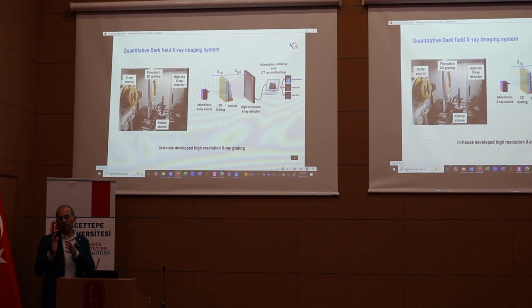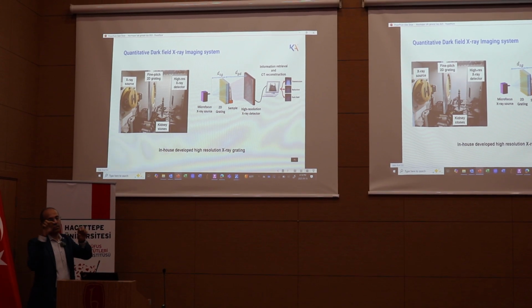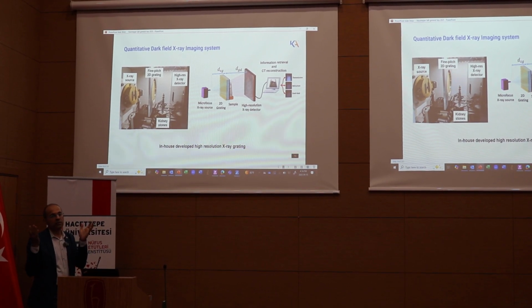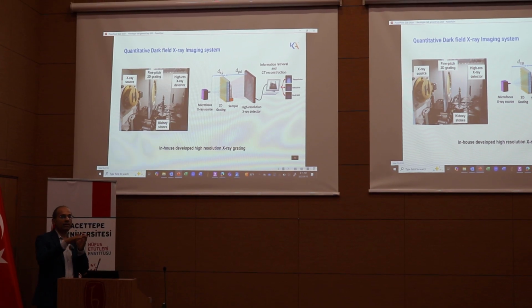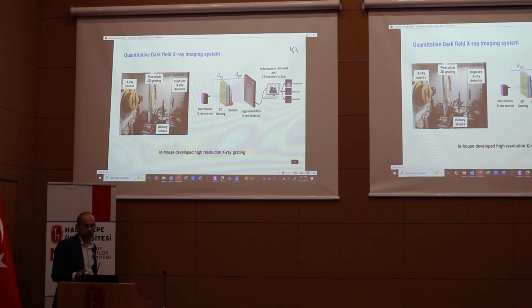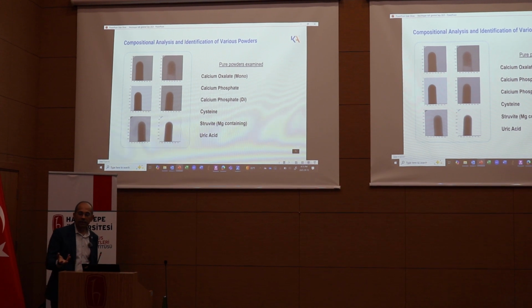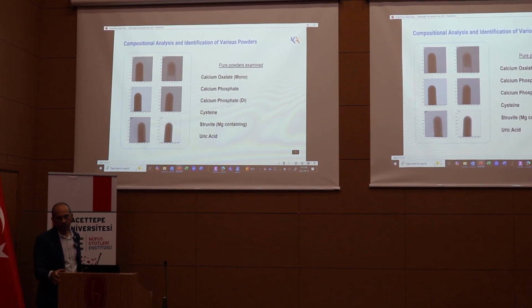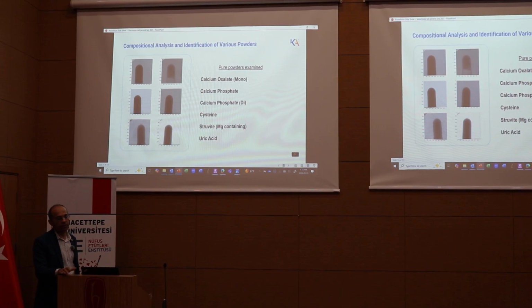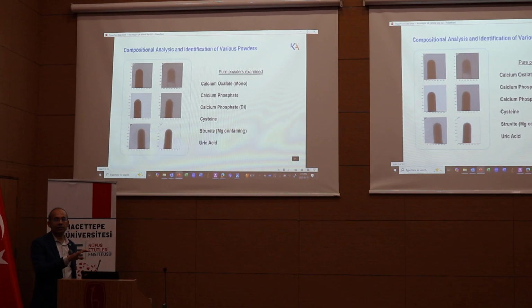A grating is nothing more than exactly what it sounds like. A piece of semiconductor with different heights and X-ray attenuation. So some X-rays pass through some parts unimpeded, and in other parts they get absorbed. So we built these very high resolution gratings, and now that we've got the quantitative element and we can solve this equation, called the transport of intensity equation, we can extract phase information in addition to scatter information, along with the attenuation.